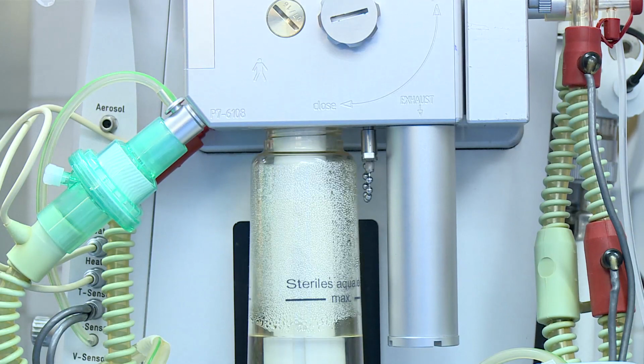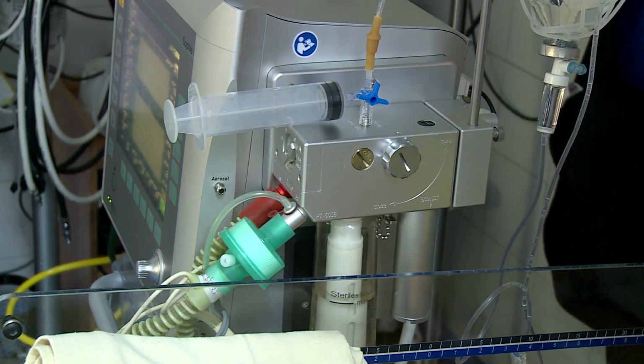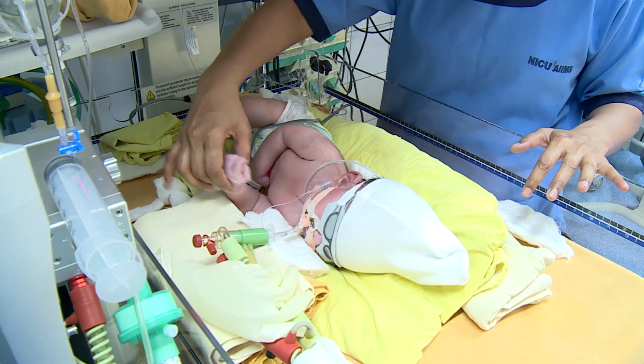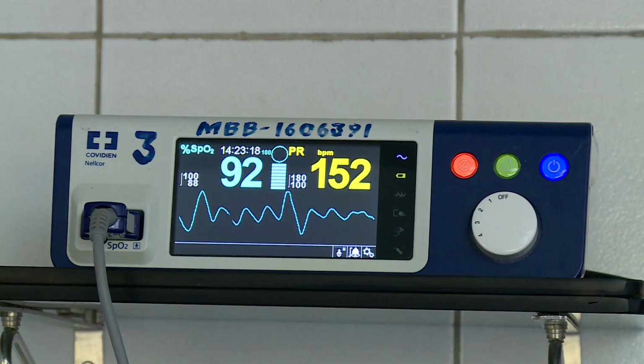Check for humidification of the ventilator regularly, as improper humidification is associated with repeated tube blocks and can result in necrotizing tracheobronchitis. Be vigilant in monitoring clinical signs of deterioration by looking at chest wiggle, blood pressure and saturation.